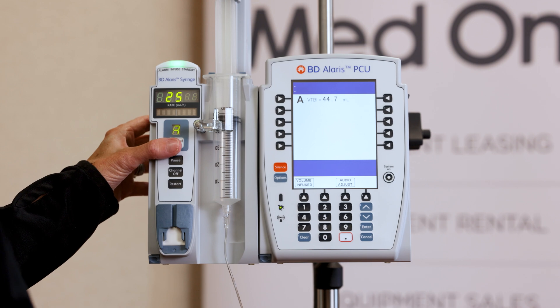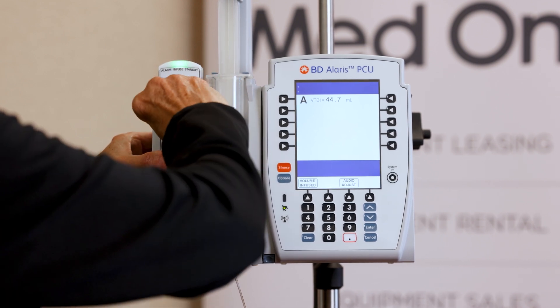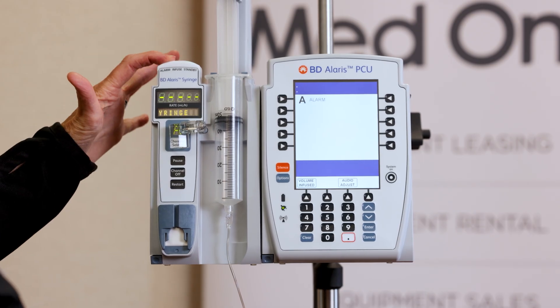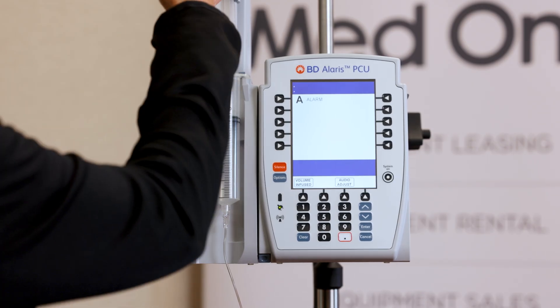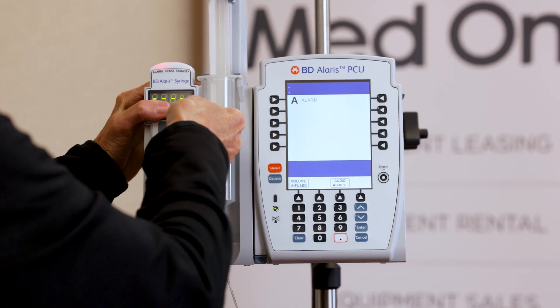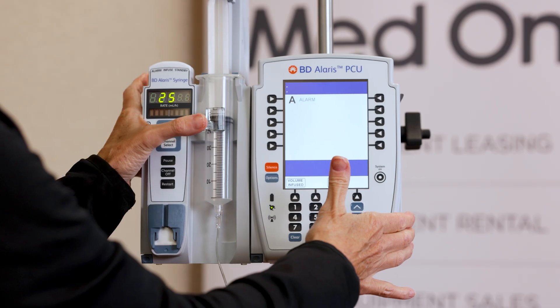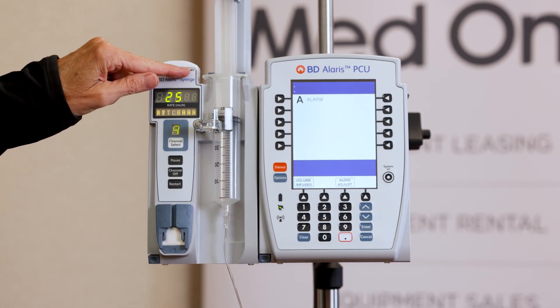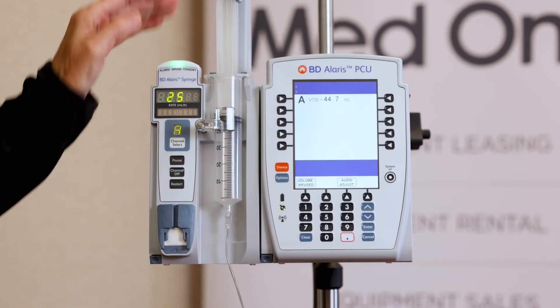Now I'm going to show you what happens if I did not have the barrel clamp in place. It's beeping red because it's an alarm — troubleshooting says check your syringe. So I come over and do my three-step load and see that I forgot to do that. I make sure that's put in there properly and I'll restart it. Now it's in standby because I need to restart the channel, so I'll press restart and we're good to go.